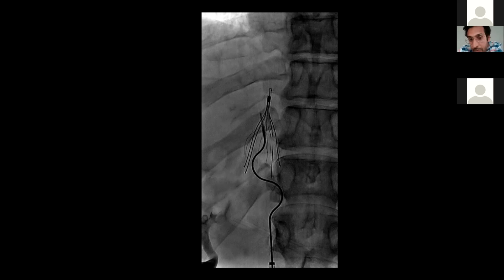This is a little bit sphincter-tightening in the sense that you don't want to get this device caught in the filter. I'm not sure even in retrospect if I would do this again, but you just want to be very careful if you're doing something like this. To our surprise, it didn't do anything. It didn't touch it at all. For all intents and purposes, cleaner wasn't the right thing for this.